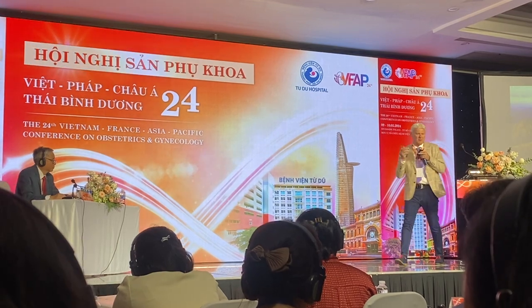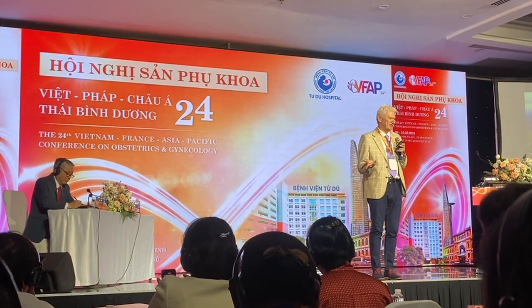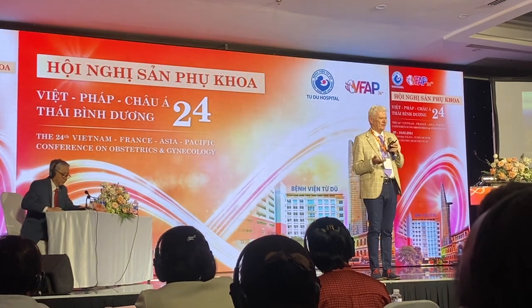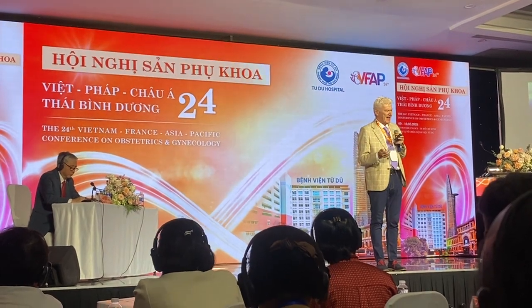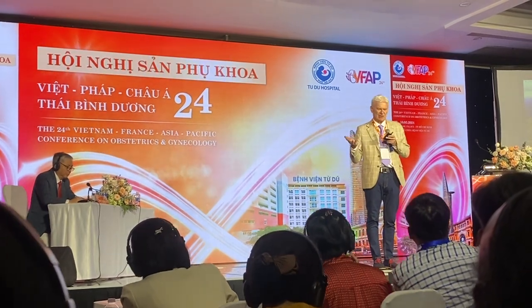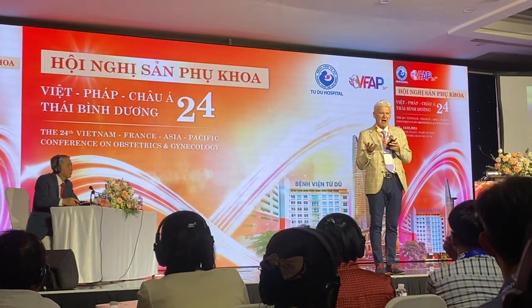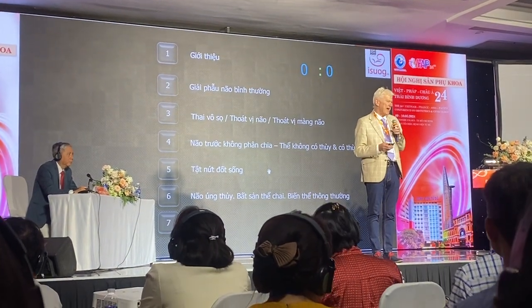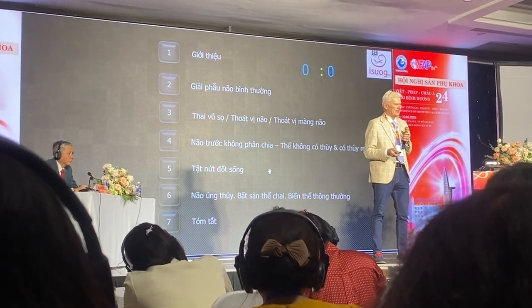The protocol for performing a scan in the first trimester of pregnancy now looks very similar to the second trimester of pregnancy. And if you actually look at the published data, the detection rate of fetal malformation in the first trimester is very similar to the second trimester. I don't think many women want a diagnosis of a major abnormality at 20 weeks. They want a diagnosis in the first trimester. And even for the minor abnormalities, they want a diagnosis in the first trimester because it gives you the chance to initiate genetic testing early in the pregnancy.